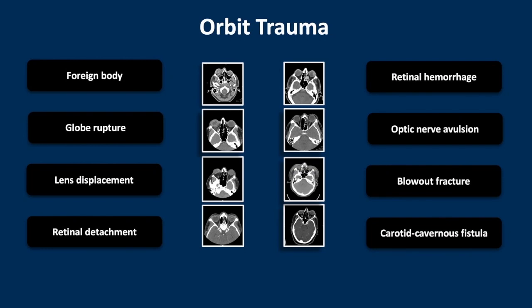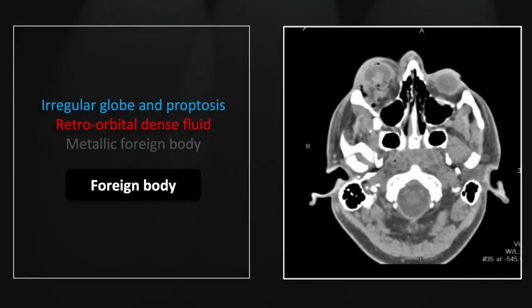Our topic for this session is orbit trauma. We'll begin with the obligate foreign body — 'you'll shoot your eye out.' This case is not subtle: you can see the abnormal contour of the globe, consistent with a globe rupture.